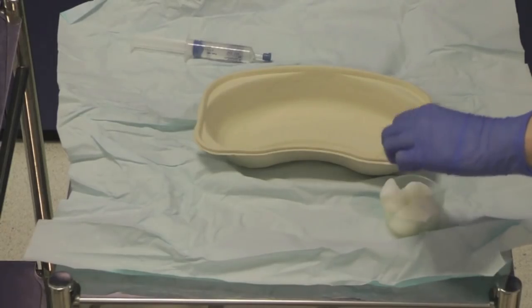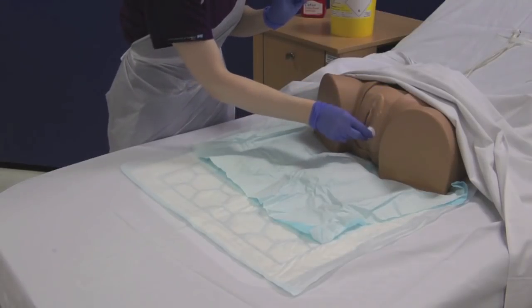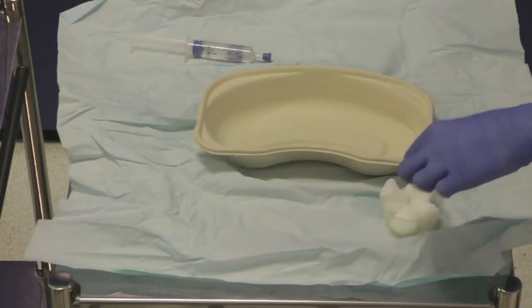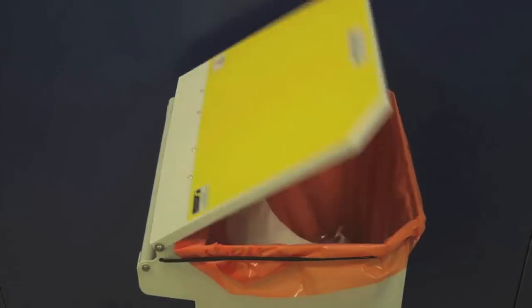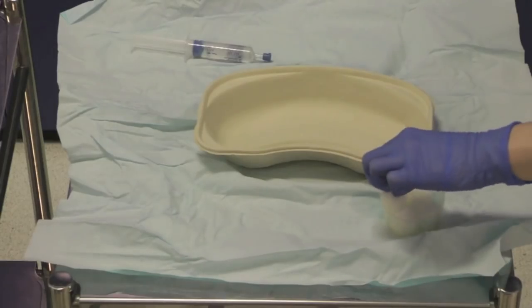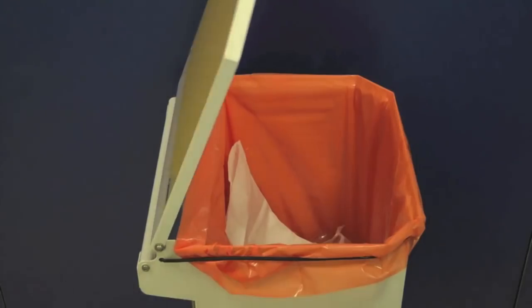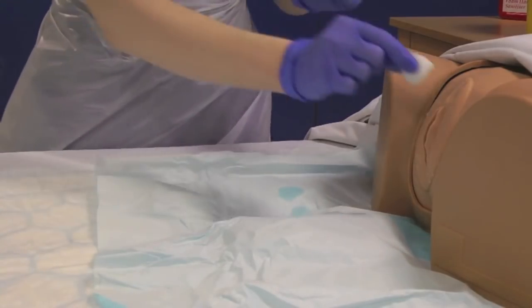It may be necessary to part the labia at this point using the sterile swabs. UHL policy utilizes a clean hand, dirty hand technique, as demonstrated here. Use your clean hand to pick up the sterile cotton wool balls and pass them to your dirty hand. This ensures that your sterile field is not contaminated. The dirty hand is the only hand that touches the genitalia.